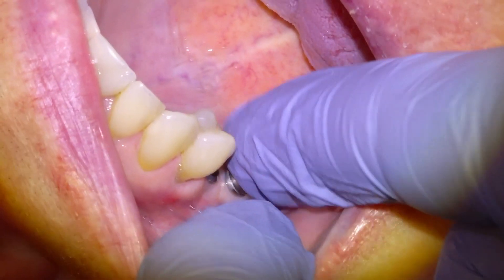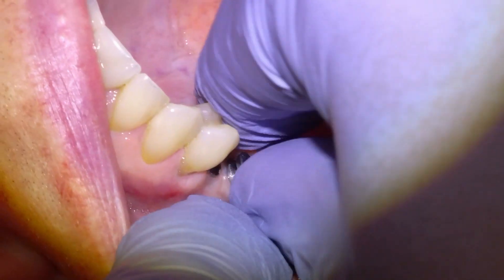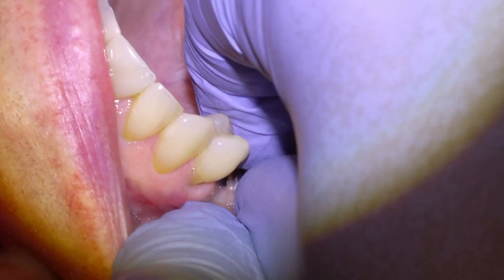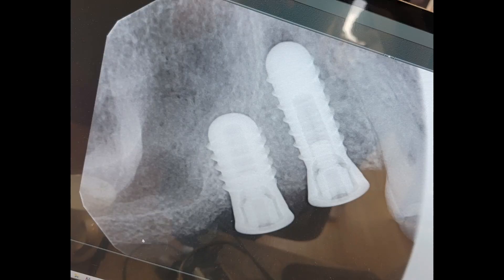We had placed a couple of implants in the area where the teeth were missing a few months ago, and here's an x-ray showing how the implants look in place — we were happy with that. The next clips are going to show how we actually make the bridge that goes onto the implants.